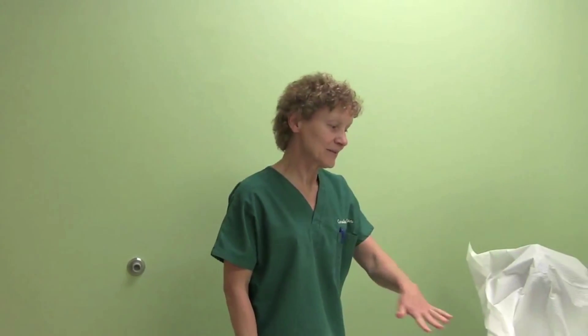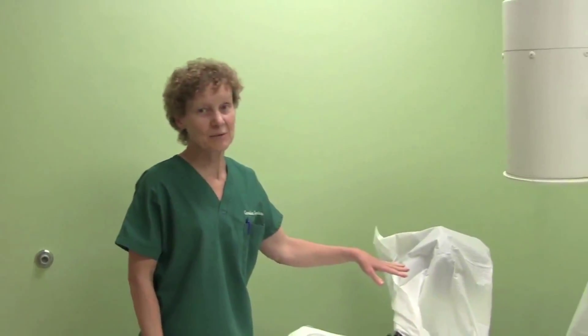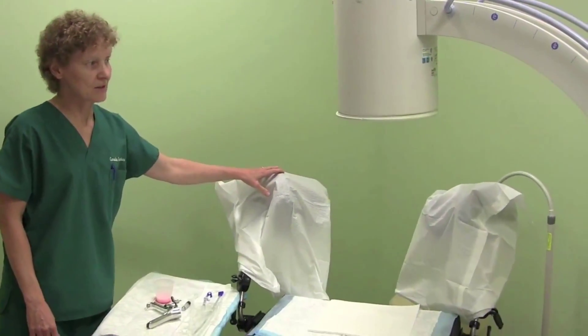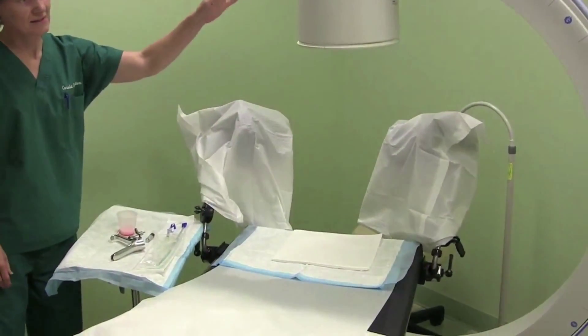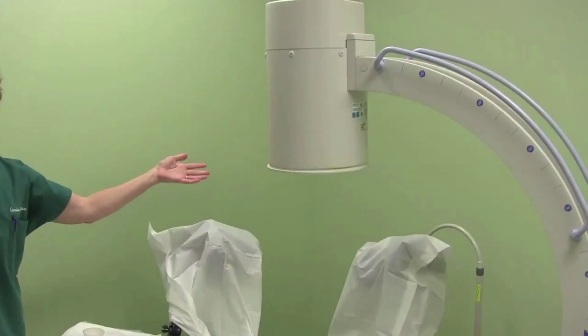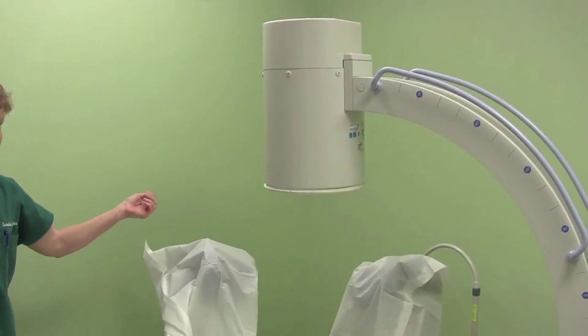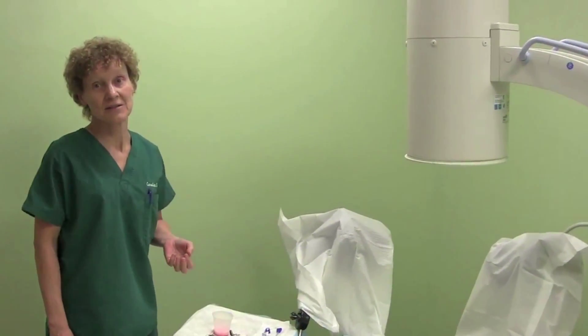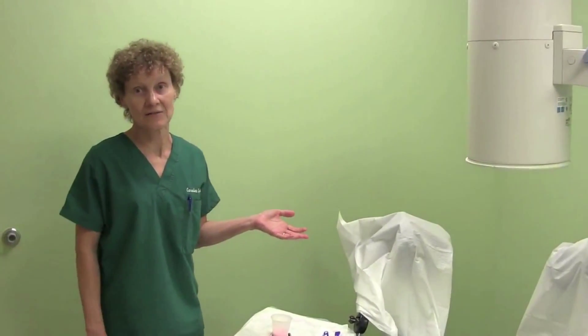This is the typical table that the HSG will be performed on. We just have women drape their legs over the stirrups, and this is the C-arm radiographic instrument that helps us take the pictures. The HSG can be done in any radiology office or it can simply be done in an office setting such as here at Carolina Conceptions.